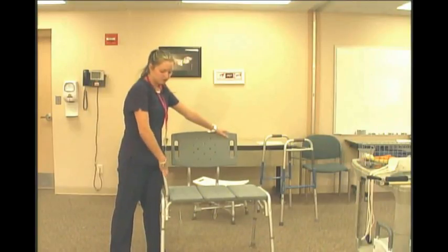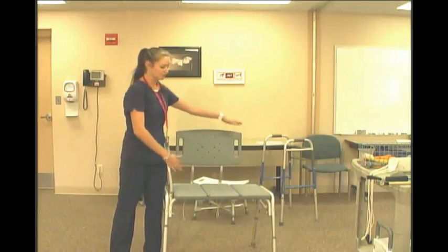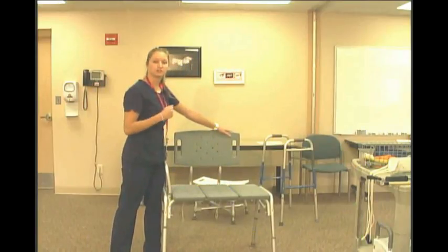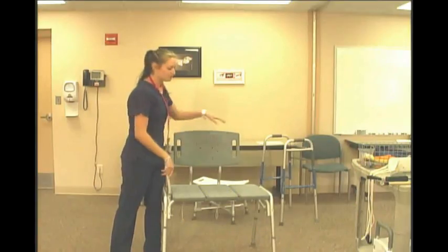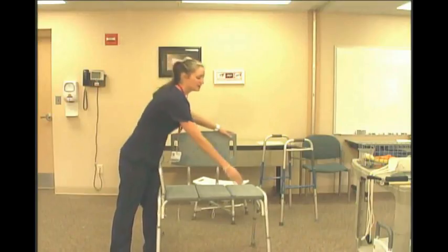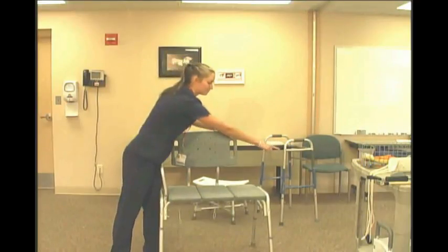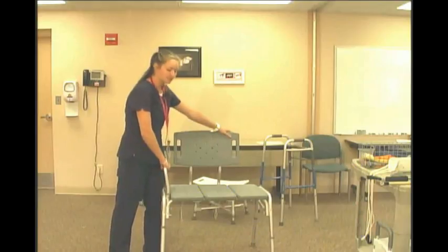The two concerns that patients tend to have with this, number one is the size. You'll notice it's pretty large. You need to have quite a bit of room outside of your tub. So if you go look in your shower and see where your faucets are, the direction you'll need to face, you need to make sure you have at least 6 or so inches to allow for these legs to fit outside. You'll also need room for you and your walker because you have to come over to here and sit before you can slide across. The other concern becomes the cost.